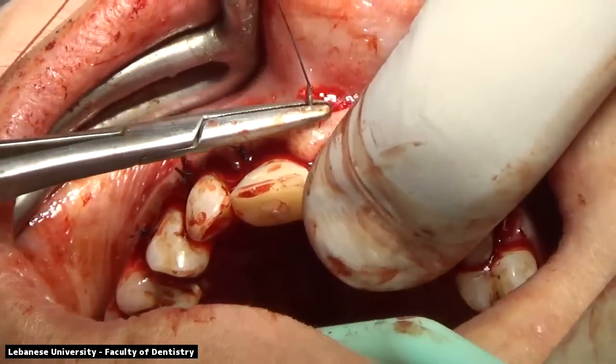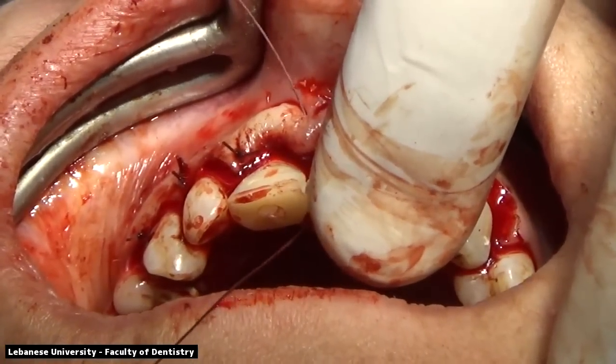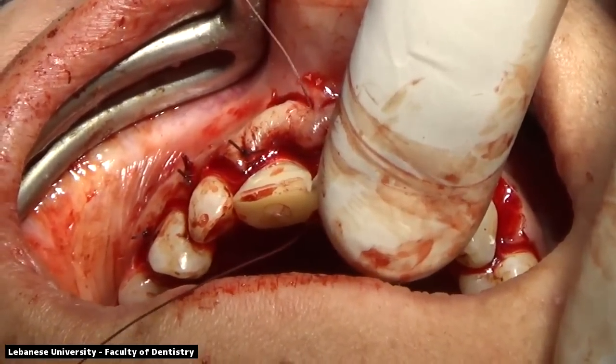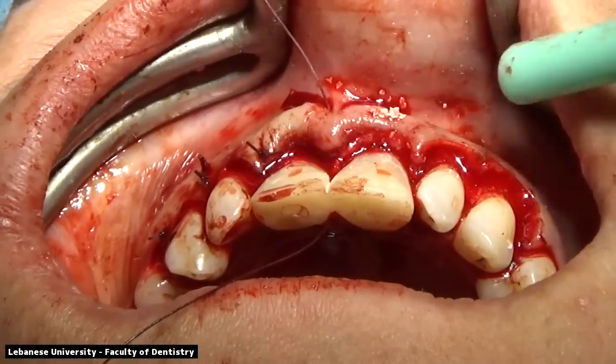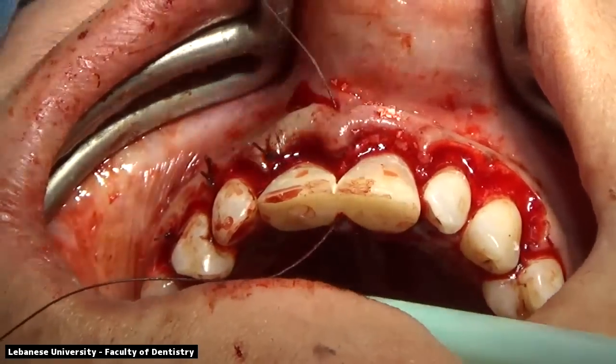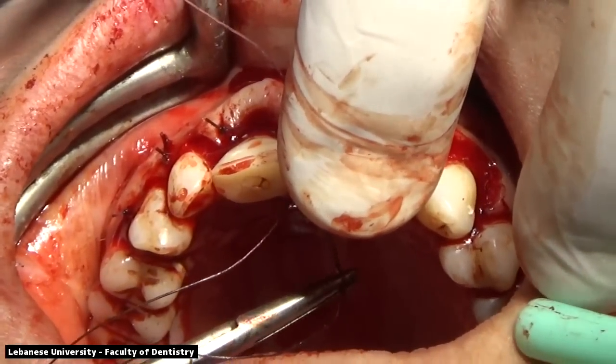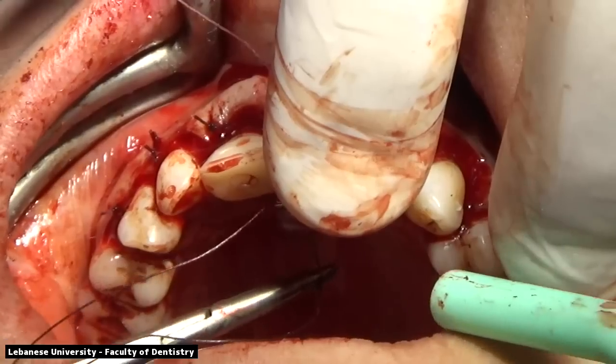Going to the base of the papilla to start our first knot, not the tip of the papilla. Going under the embrasure site. It's very important that those embrasures between the two centrals have been opened widely to allow for the soft tissue adaptation and the papilla adaptation at the site. Going into the palatal.